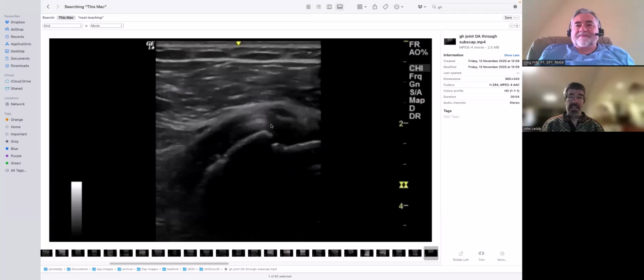But if you think it's a structural thing around an extra rib or some fascia there, you'd have to do a lot of it, I think, and have a very specific patient group before you would develop the skills necessary to see anything useful with any sort of reliability. Good. I'm not going to spend any more time on it then, John.